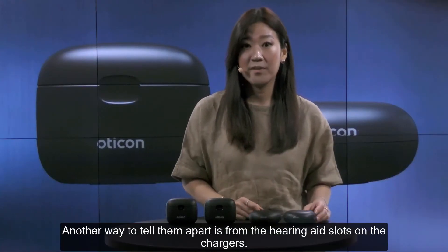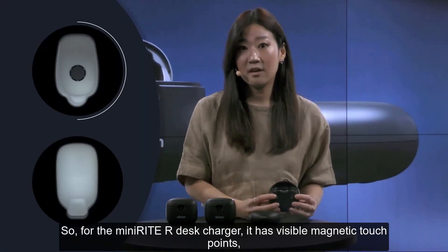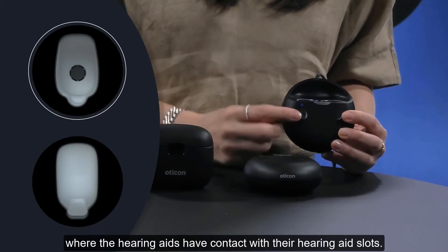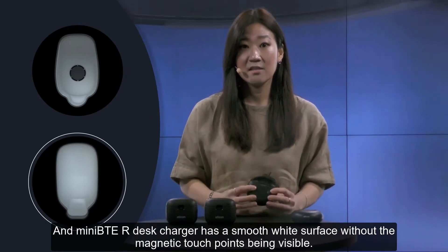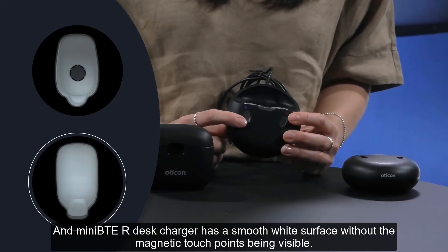Another way to tell them apart is from the hearing aid slots on the chargers. The Mini-BTE R desk charger has visible magnetic touch points where the hearing aids have contact with their hearing aid slots. The Minirite R desk charger has a smooth white surface without the magnetic touch points being visible.